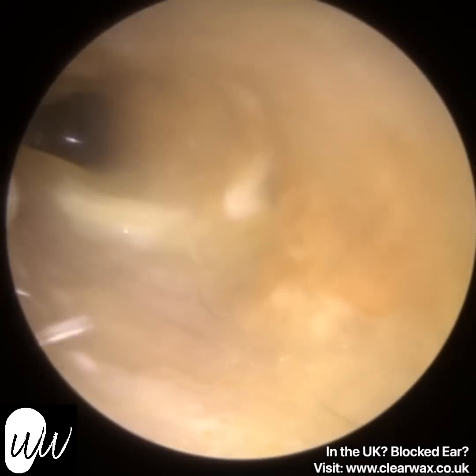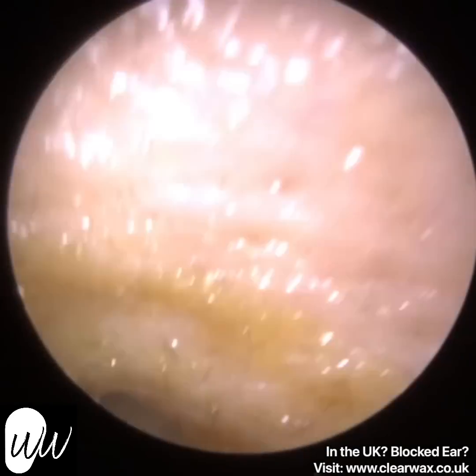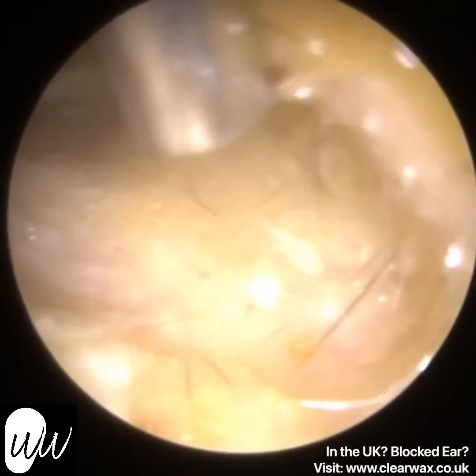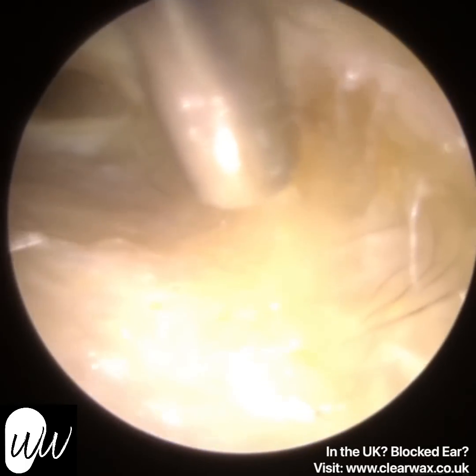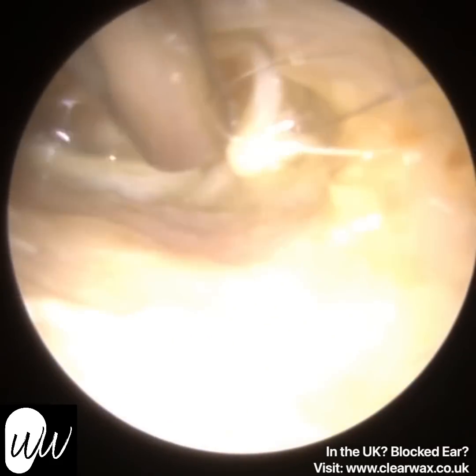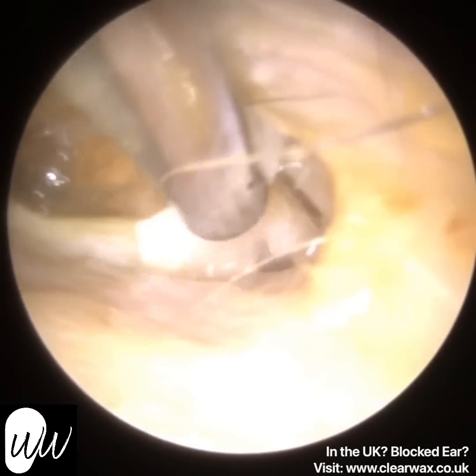This is a patient who attended with ear infections in both ears, but what was obscuring the view of the ear infections was, this is the patient's left ear, and this ear had a combination of earwax and discharge and debris due to the ear infection.